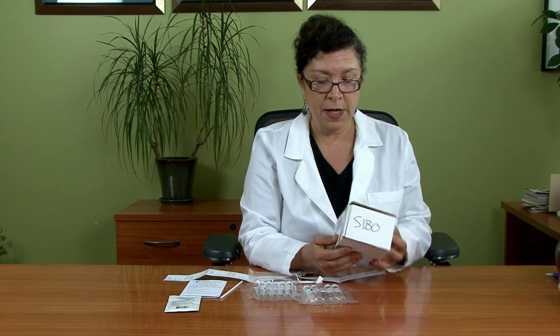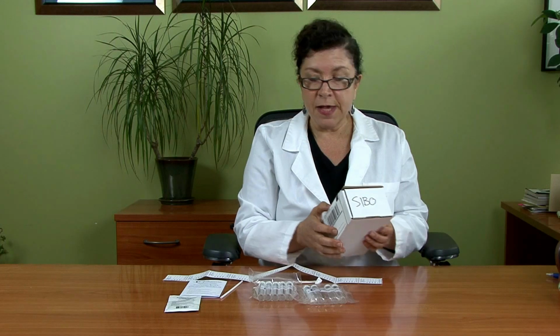And you're going to go to your nearest UPS drop box or station, and you're going to go ahead and drop this at UPS. Now, if you have any questions on how to correctly collect your SIBO test, please don't hesitate in calling the clinic.